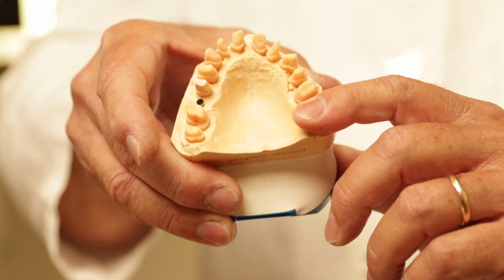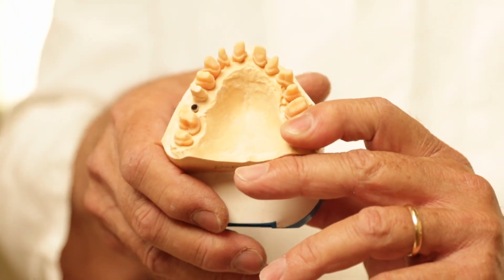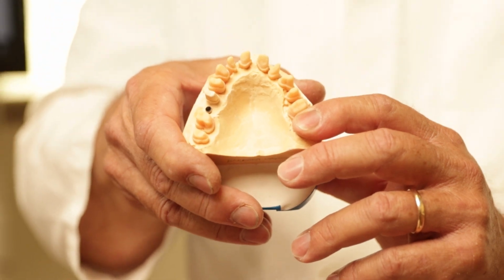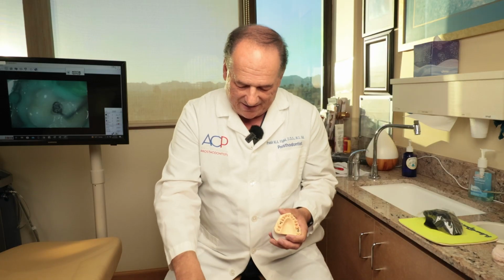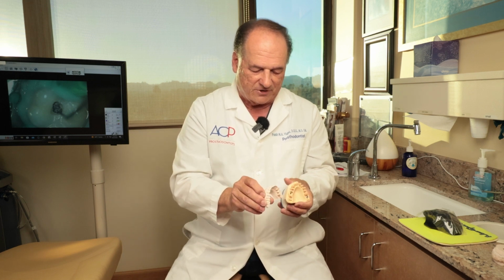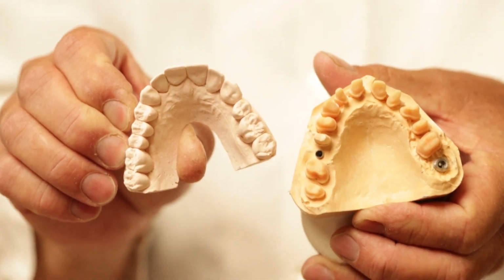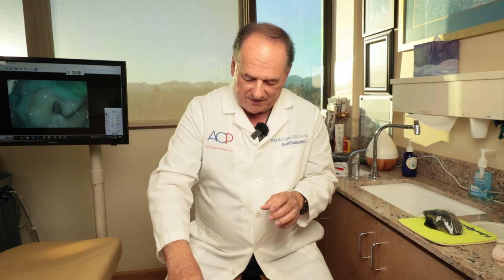In a normal circumstance before the 1980s, in this country, we would not have been able to put a tooth back here for this patient, but now we can. And then at the end, it would be very difficult to say which one's the implant and which one's the tooth. So you create a method of hygiene.